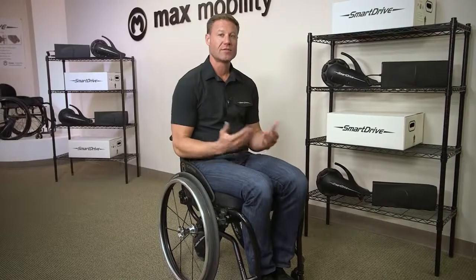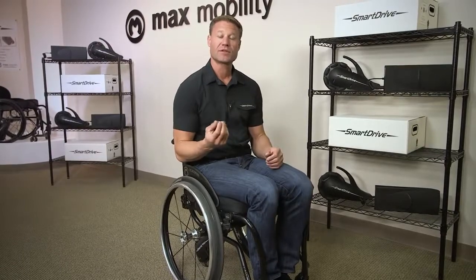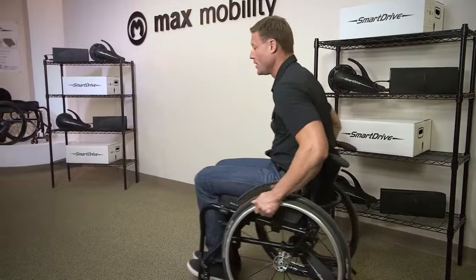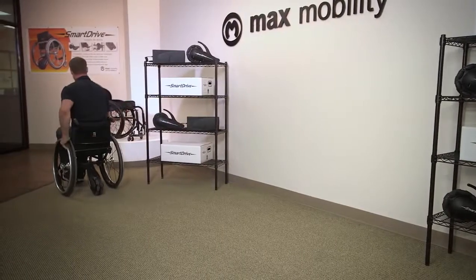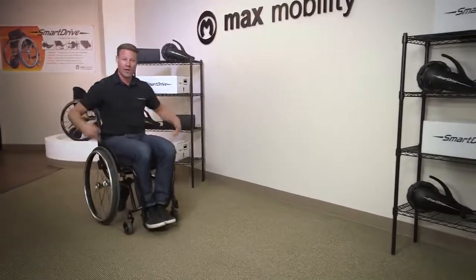In indoor mode, you can also stop the motor by braking on the hand rims. So this is done by resisting the motor and slowing your chair down by about 10% of your speed. It's very simple and very natural to do. So give it a push to go. The motor's turning. Now I'm going to grip my hand rims and simply slow down the chair to turn it off. Again, pushing to go. Now I'm going to brake on the hand rims to turn the motor off.